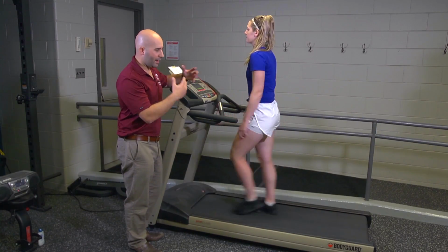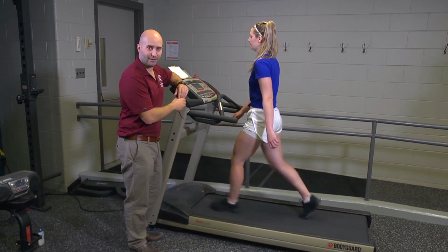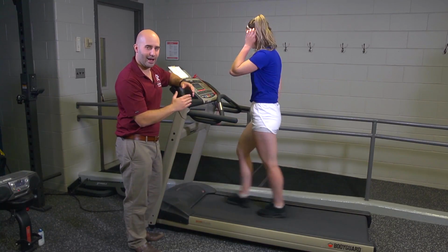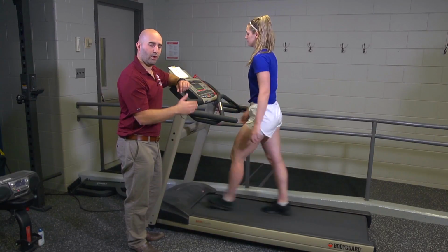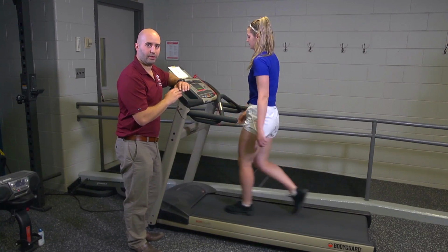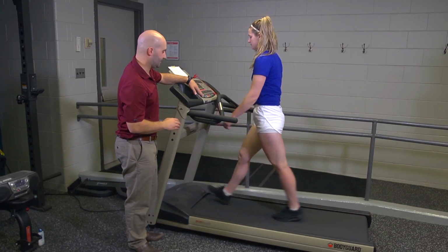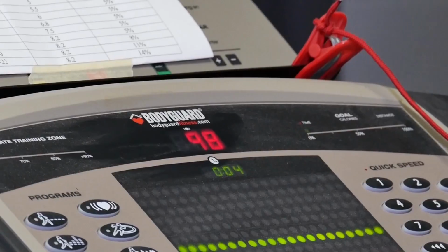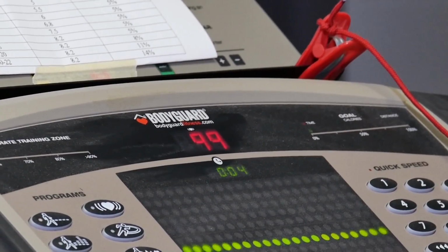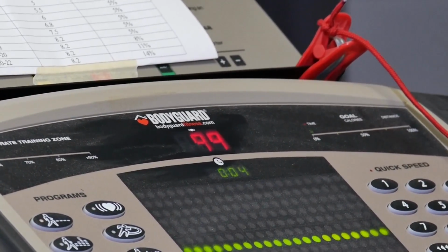Now, without actually going through the entire procedure of the test, let's say the speed is appropriate and I have my target heart rate and it's steady state. Once it's time to get into the working load, the only thing you're going to be changing is the elevation. That's it, and it's okay that the heart rate will then probably climb outside of that 120 to 150 range. That's how the test is supposed to work.